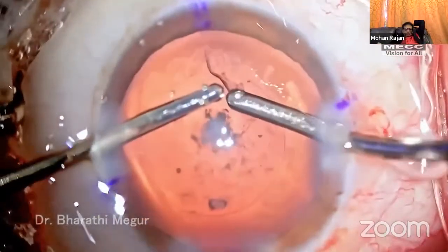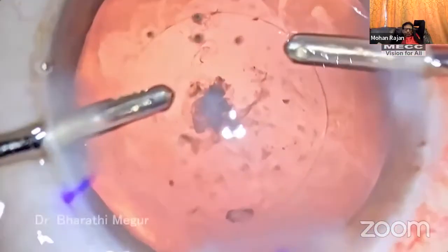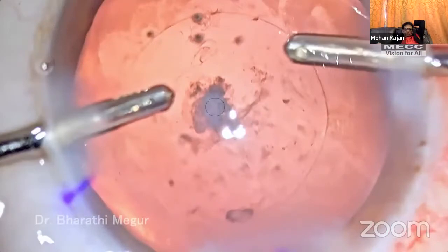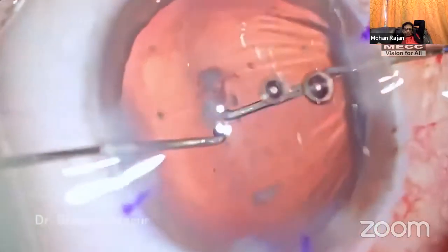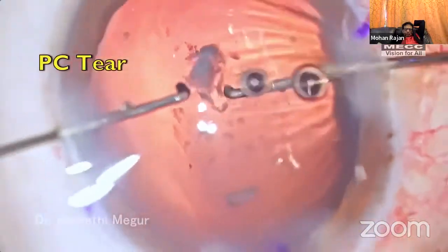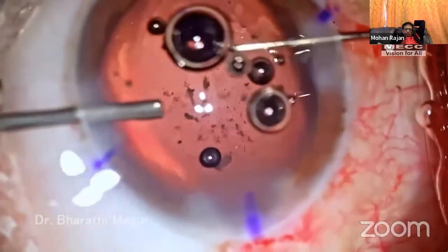OVD is injected each time before removing the irrigation cannula to prevent shallowing of the anterior chamber. Maintaining anterior chamber equilibrium is the golden rule in these cases. This is probably the most important step which minimizes the occurrence of PC tear in such vulnerable eyes. Slowly but safely, all the cortex is removed. However, there is a small central plaque sitting near the visual axis. It is not getting displaced with OVD. I try to nudge it with the dialer, and a posterior capsular tear happens. The anterior vitreous face is still intact and there is no vitreous disturbance.